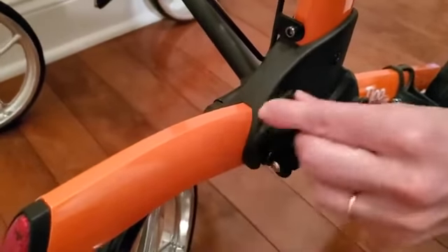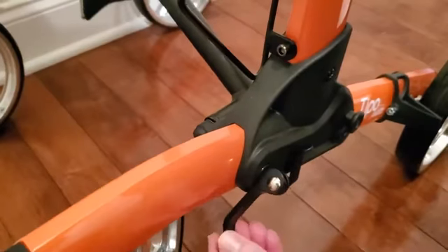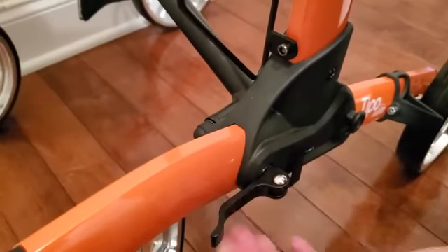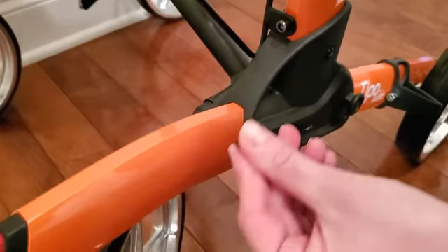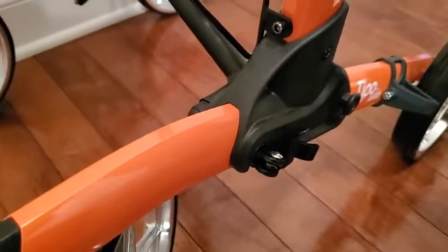Just make sure that you position it correctly so that it is as close to the structure of the walker as possible, and then you will easily be able to slide it in and lock your handlebars.